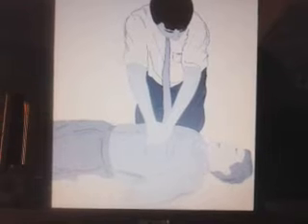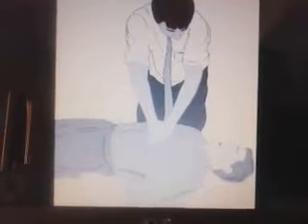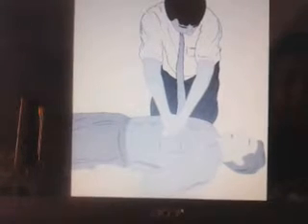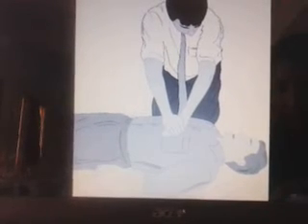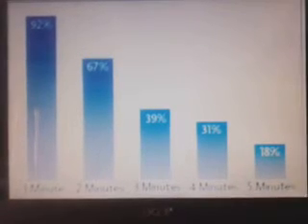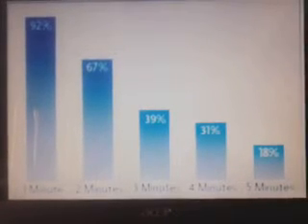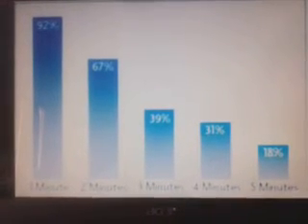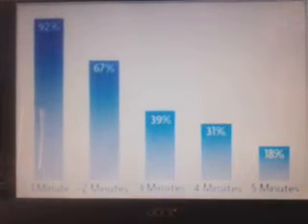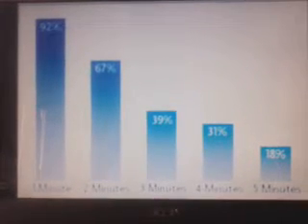CPR is performed using a combination of rescue breaths and chest compressions. The three factors needed to perform successful CPR are quickness, forcefulness, and consistency. Manually performed CPR has several limitations. Humans experience fatigue. A major cause of inconsistency is fatigue. Losing consistency means stopping the flow of blood, and after some time, the patient's organs suffer from lack of oxygen. The quality of the compressions will be lower as time elapses. All these limitations can be overcome using electromechanical CPR.